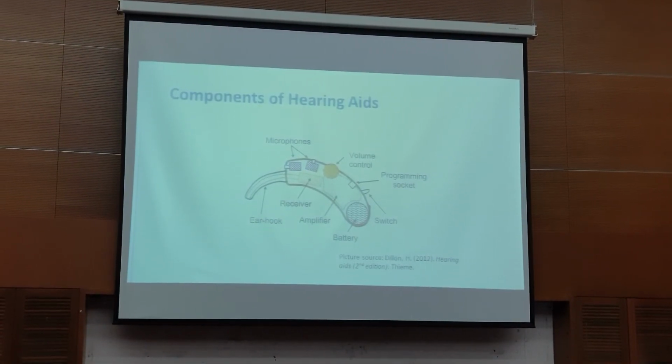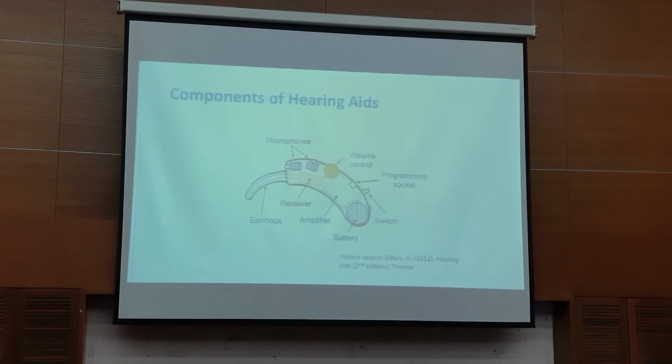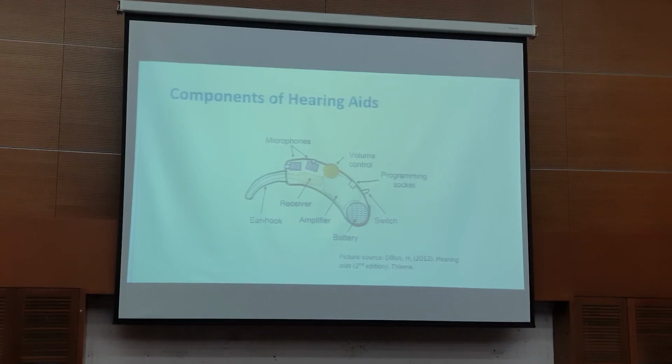You faham fungsi filter tak? Filter ni dia allow those frequencies that you want, but discard those yang dia tak nak. Tapi bila dah masuk speech sounds and also noise kat dalam the same filter, you think it's easy to take it out? It's not. Sebab tu you tengok all the hearing aid technologies, they give macam-macam cara and they say to improve clarity dan sebagainya, but it's actually very difficult. Alright, very difficult. So we need to understand that.